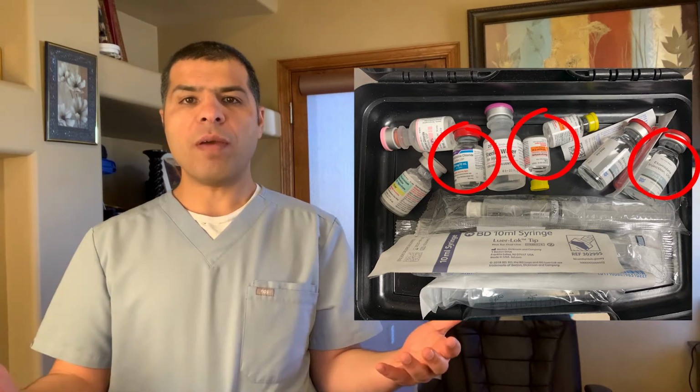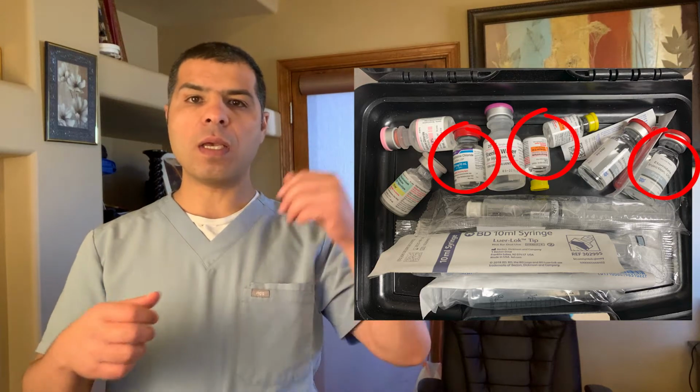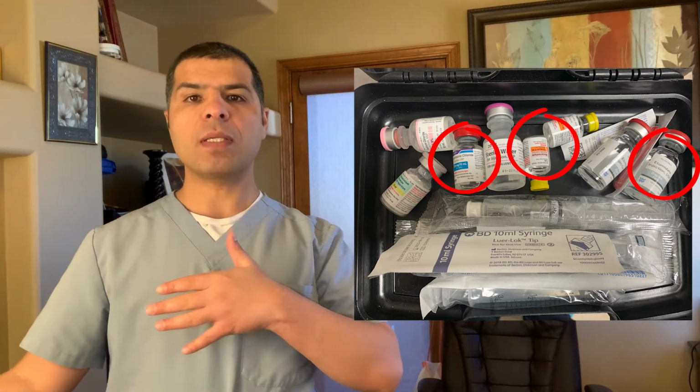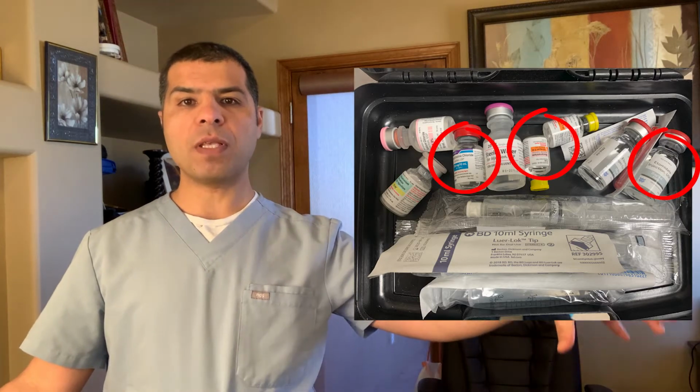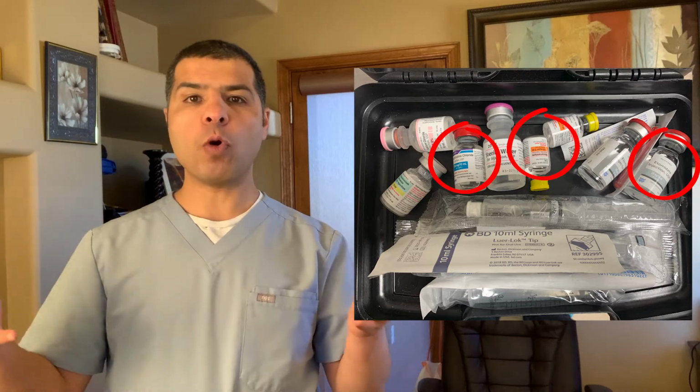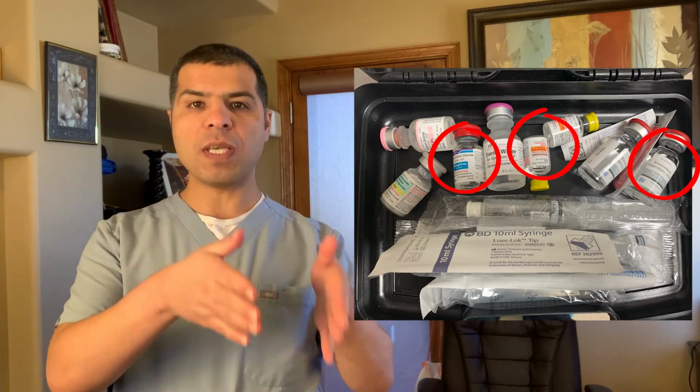Now, why do we have that kit? Because otherwise I have to tell them, hey, I need, let's say, etomidate. Then they have to obtain it from the local Pyxis, which is the electronic pharmacy they have in the unit, or they have to get it from the pharmacy, and that may take a few more minutes. But the kit is right there, they open it, and the medication is in there.